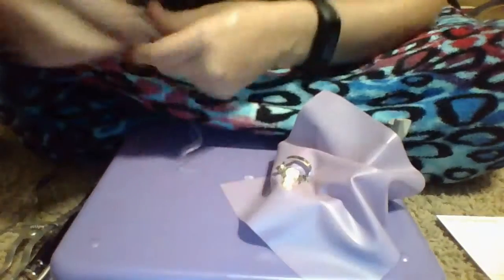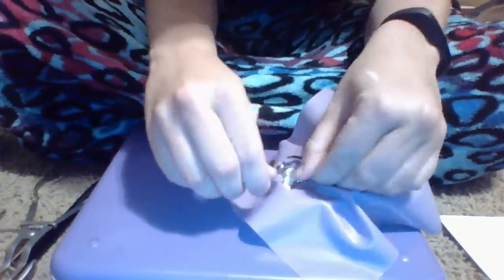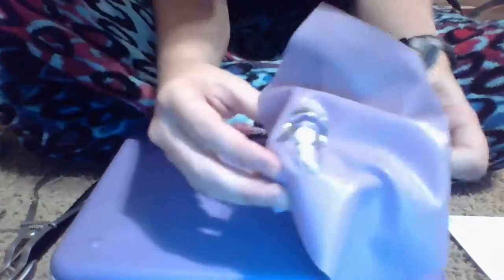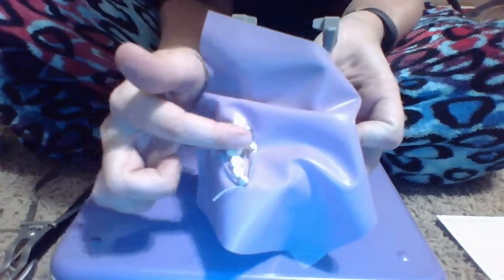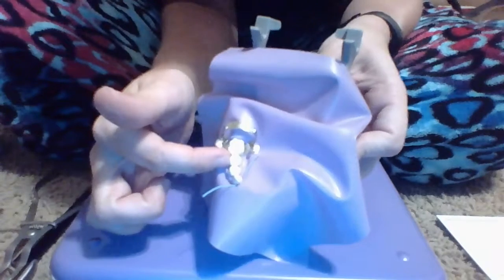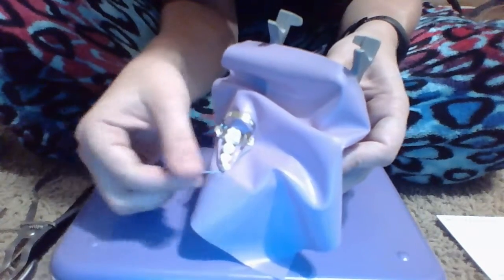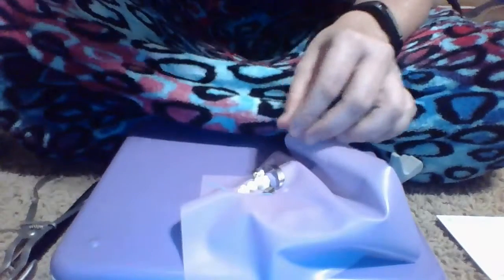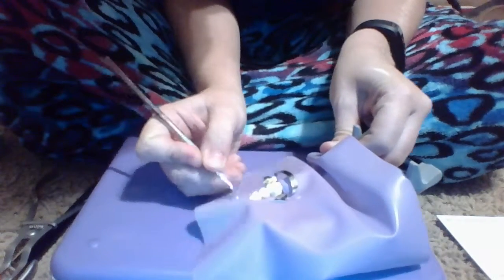I'll make sure those are really good and in there, and I'm going to go ahead and place my wedget material right now. This goes in the very front of wherever you have your last hole placed. I have the clamp above tooth 29, the tooth I'm going to be working on, and the wedget on the last tooth, which is 27. It just creates a barrier so any product doesn't flow down. Then I'll use my explorer to push it down because I want it to be as close to the gingiva as I can without exposing the gingiva.